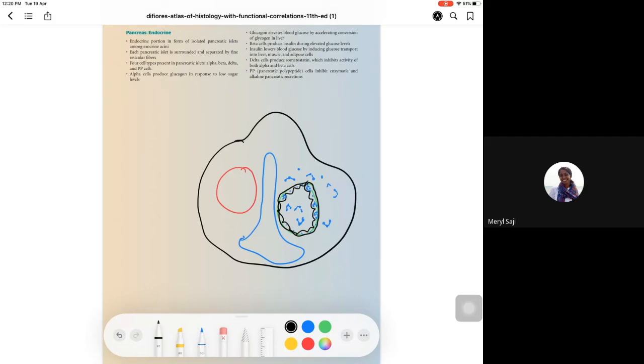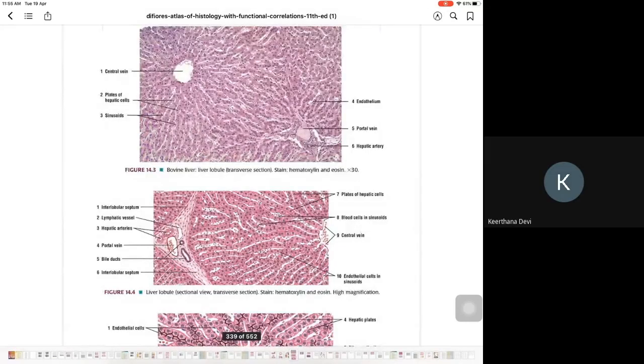And whenever it is immunological, rather than neutrophils, it will be lymphocytes. For example, in a liver transplant rejection, the rejection will attack the biliary epithelium. The lymphocytes should be attacking the biliary epithelium and may be present within the lumen. But attacking the biliary epithelium is very, very important to call it biliary inflammation.